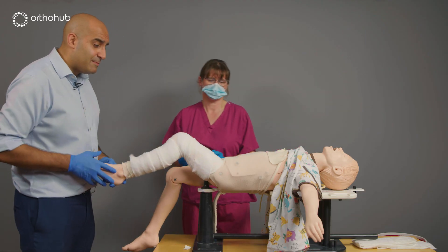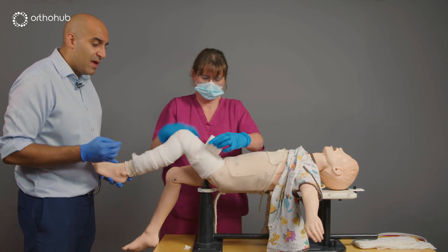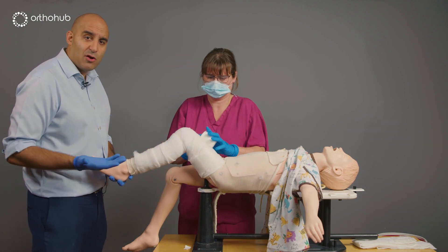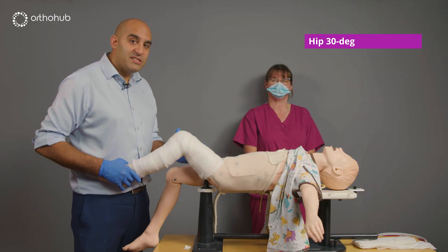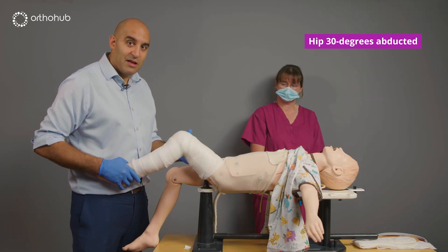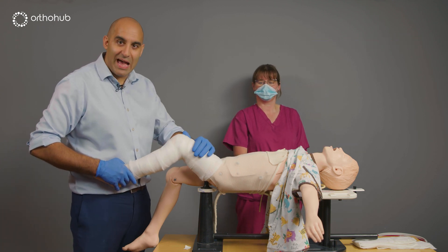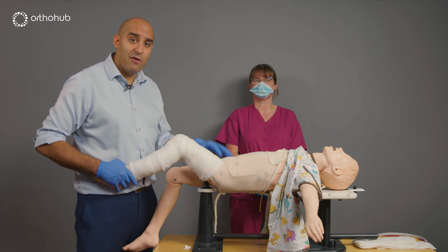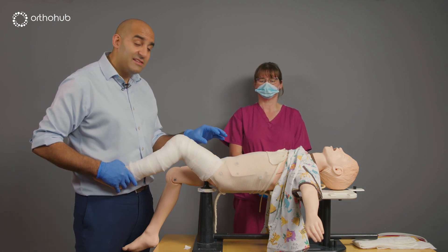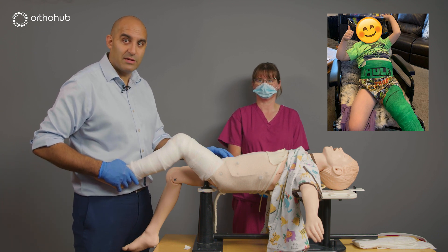We apply the tensor band first — this stops the plaster from sticking to the velband and eases removal later. You want about 30 degrees of abduction at the hip throughout. The 30 degrees of abduction allows perineal care for the child, as well as seating in car seats and prams, where they'll spend most of their time for the next four to six weeks.